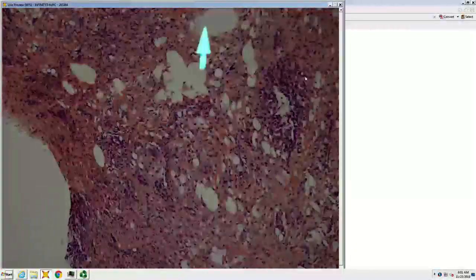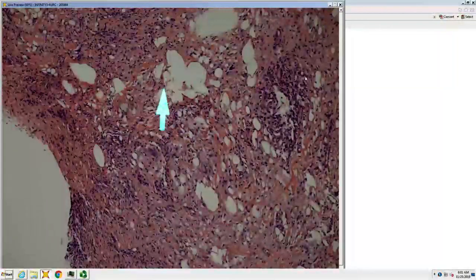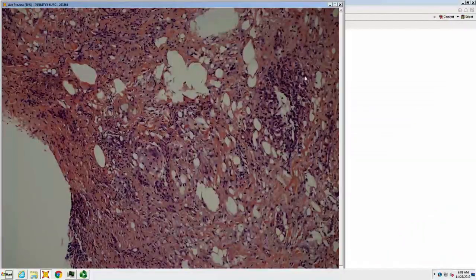Doesn't look very happy. Fat does not look happy. And you have this frost on a window pane type change. Maybe like lipodermato. And this is kind of a young, early fat necrosis. So stasis fat necrosis is lipodermatosclerosis.